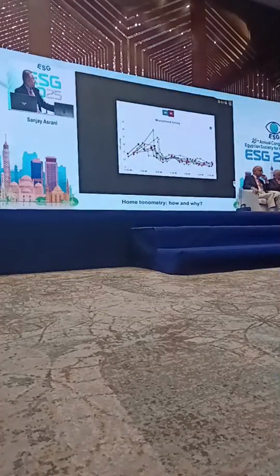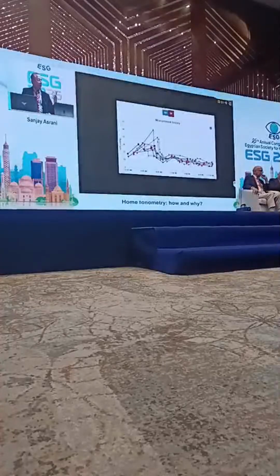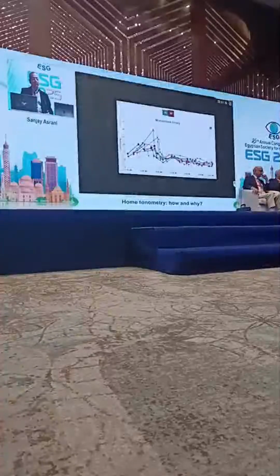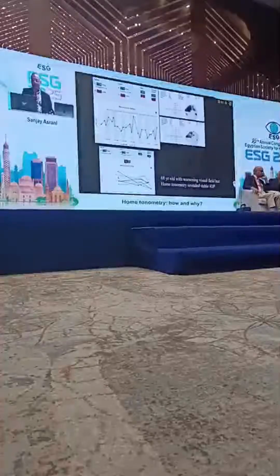All of his pressure spikes are occurring between 4 a.m. and 8 a.m. He's measuring the waking intraocular pressure spike. So once he wakes up, if he doesn't wait 15 minutes, he's going to measure the spike that occurs in all of us. This is a normal pressure spike that happens as soon as you wake up. You see, during the day, his pressures are completely controlled. So this is a false reading.